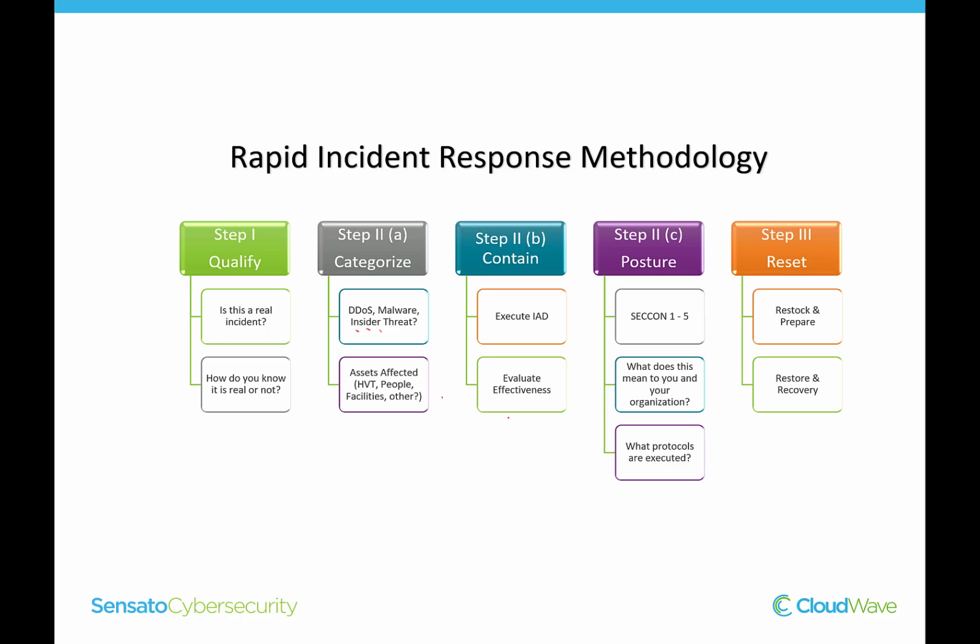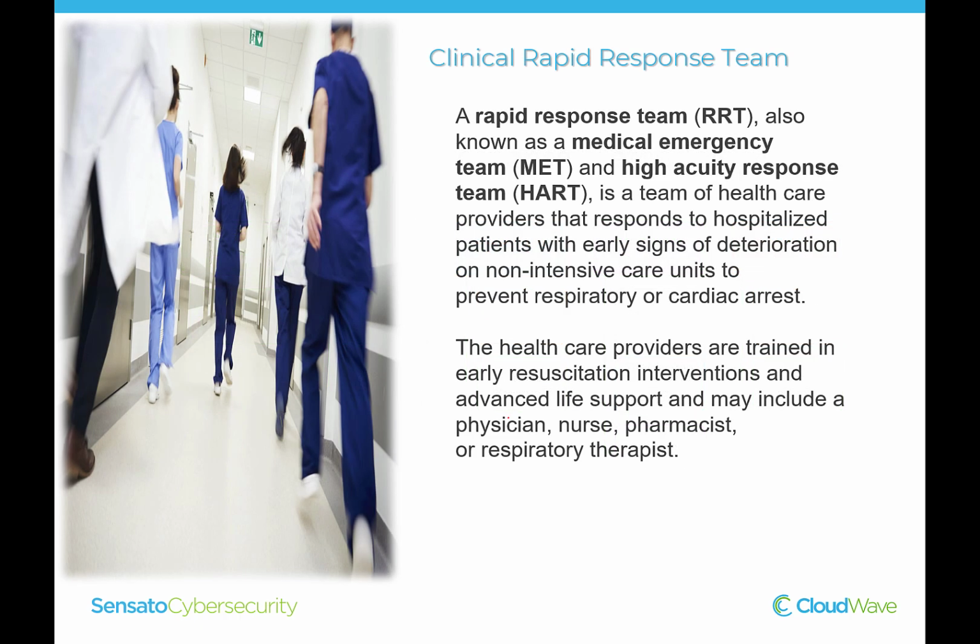So all of a sudden you've got a report, right? One of these 3 inputs that we just talked about has a report that there is an impact to patient care, and the caller or the person is observing a security incident, what is considered to be a real incident until proven otherwise. Who do we call? Well, who we call is the clinical rapid response team.